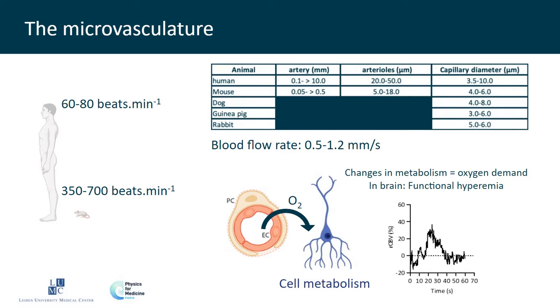Many challenges remain if you want to study the microvasculature. This is due either to the spatial resolution and sensitivity of the clinical neuroimaging modalities, or to the need for preclinical invasive techniques and the use of photonic imaging, which has limitations due to problems of tissue penetration. However, the microvasculature also offers some advantages. It is a highly conserved system between species, between human and mice, for example. Whereas mouse models are widely used to study human cardiovascular disease, as we can easily manipulate their genome, in many cases we can question the relevance of such models to study disease.